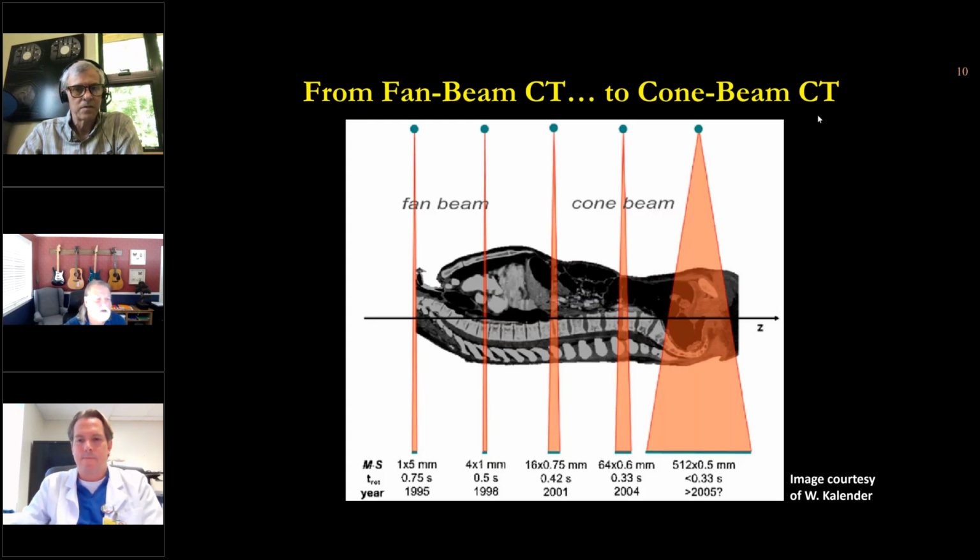Oh, one last slide for me. So what I've sort of talked about is fan beam CT, which are mostly whole body CT systems, and they have increased to multi-detector array CT systems, MDCTs as they're called. And you can see on this slide in time how the beam width has gotten greater in whole body CT.